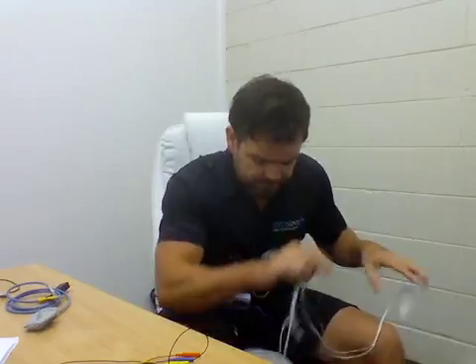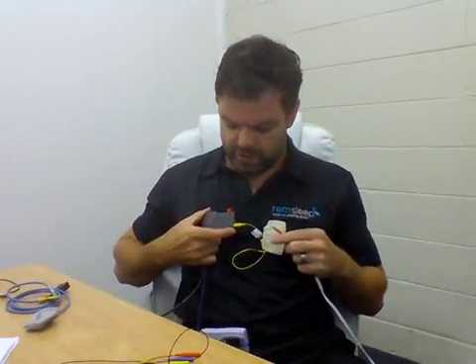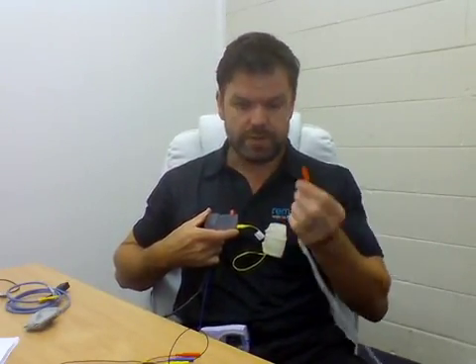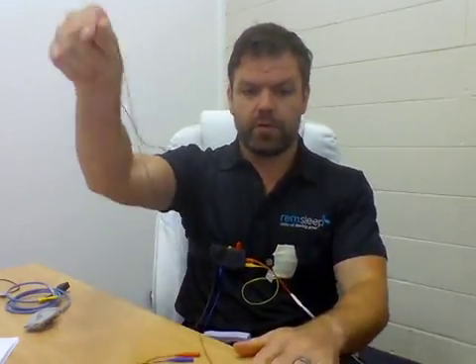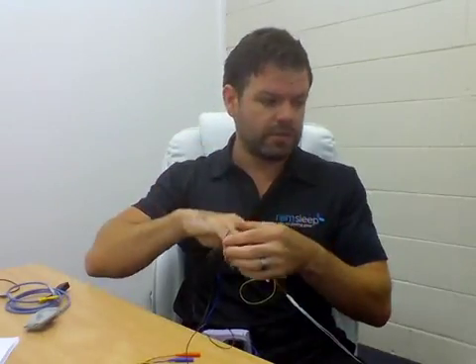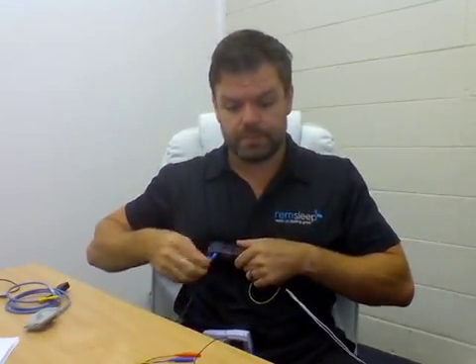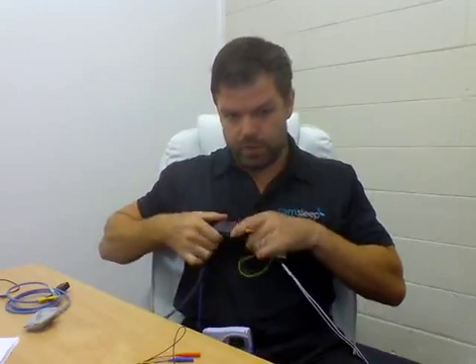That runs up. And all these wires, including the electrodes from the previous section, all connect into the head box in the colours. So this is the orange one, it goes into orange. With our black electrode before that, with all the different colours, black goes into the black. And red into red. So at the end of the study, when you look down on here, all these holes will be filled up with the correct colours.